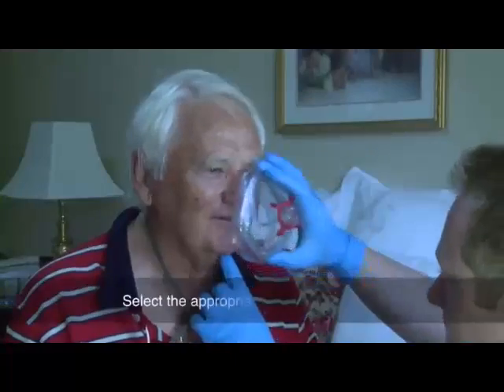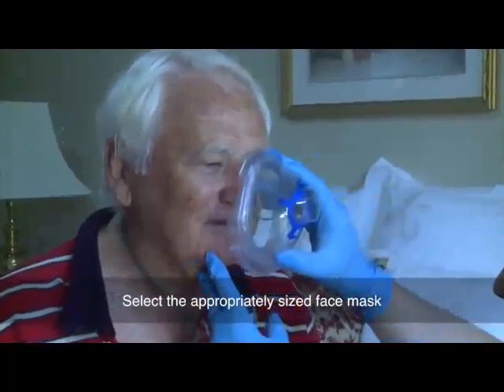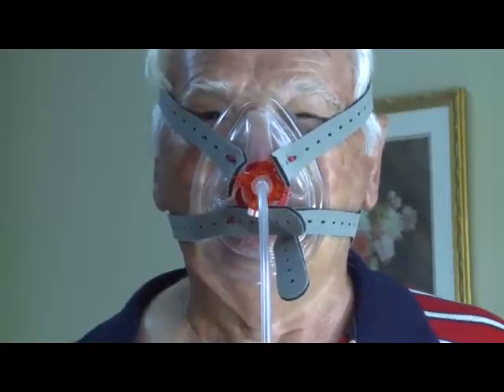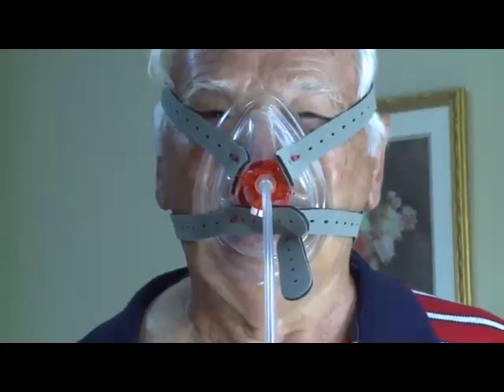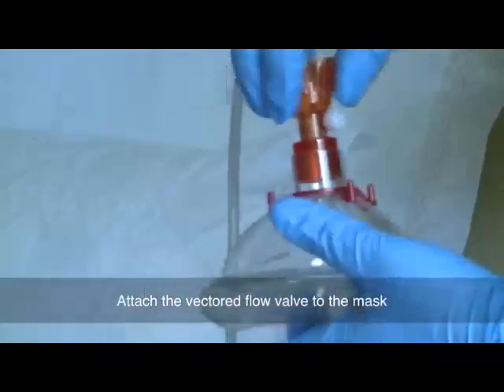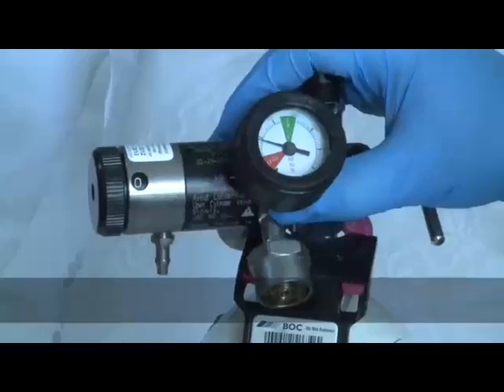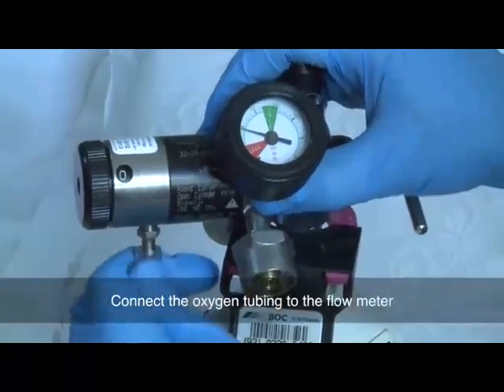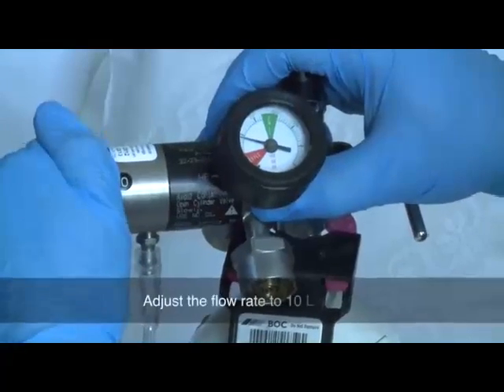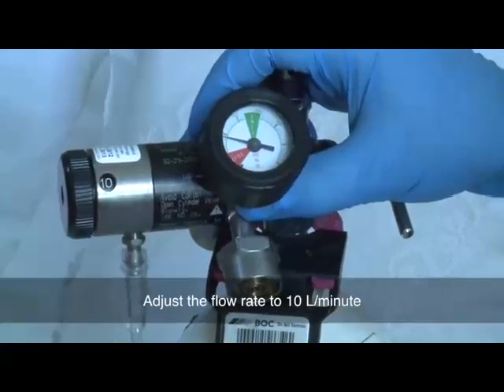Select the appropriate size face mask, ensuring that the inner circumference of the air cushion encompasses the bridge of the nose, side of the mouth and the inferior border of the bottom lip. Attach the vectored flow valve to the mask. Connect the oxygen tubing to a standard 15-litre-per-minute flow meter and adjust the oxygen flow rate to 10 litres per minute to generate 8 centimetres of water of continuous positive airway pressure.